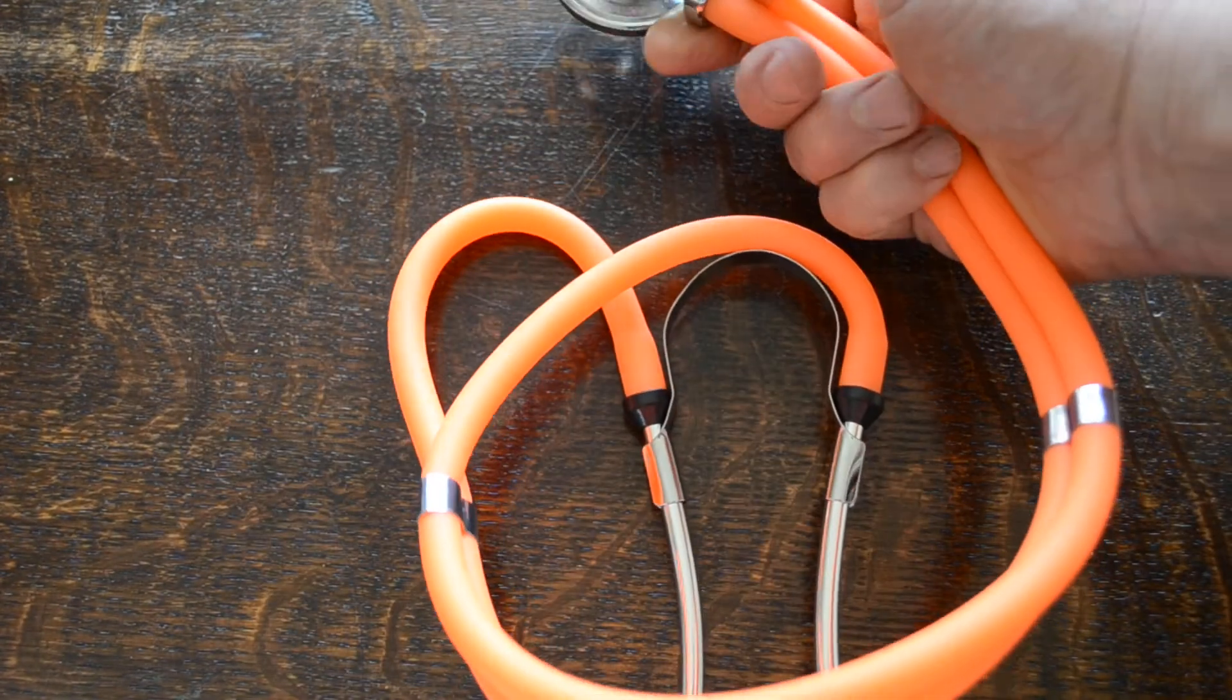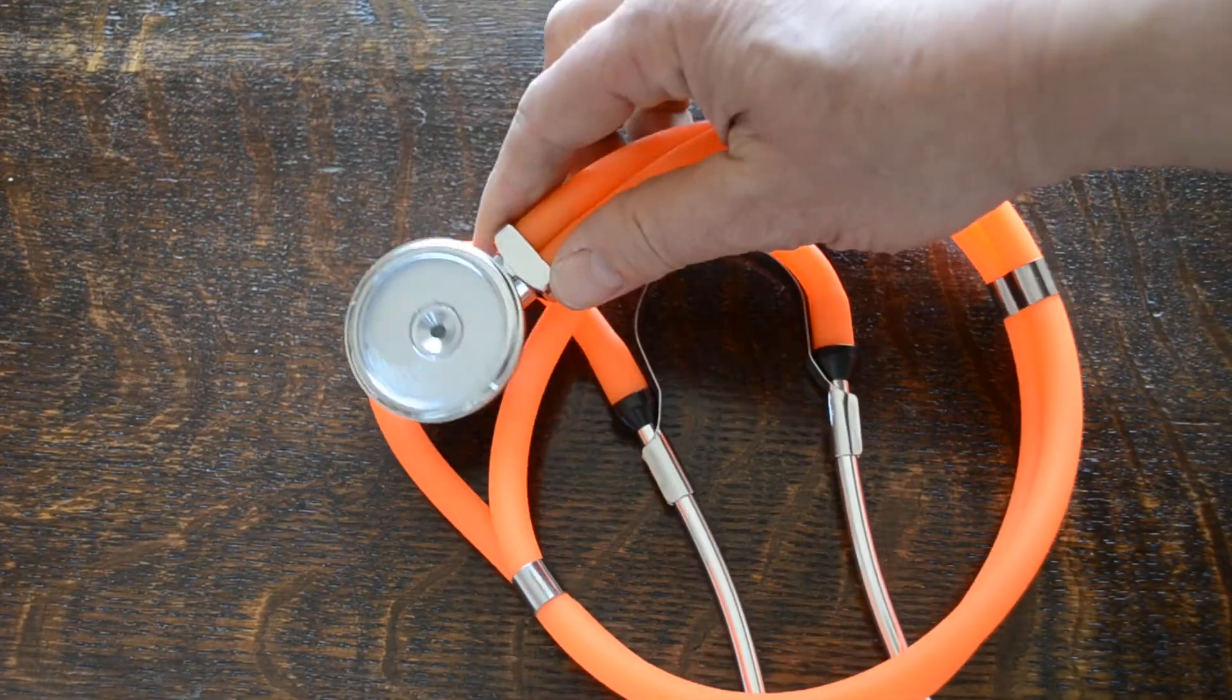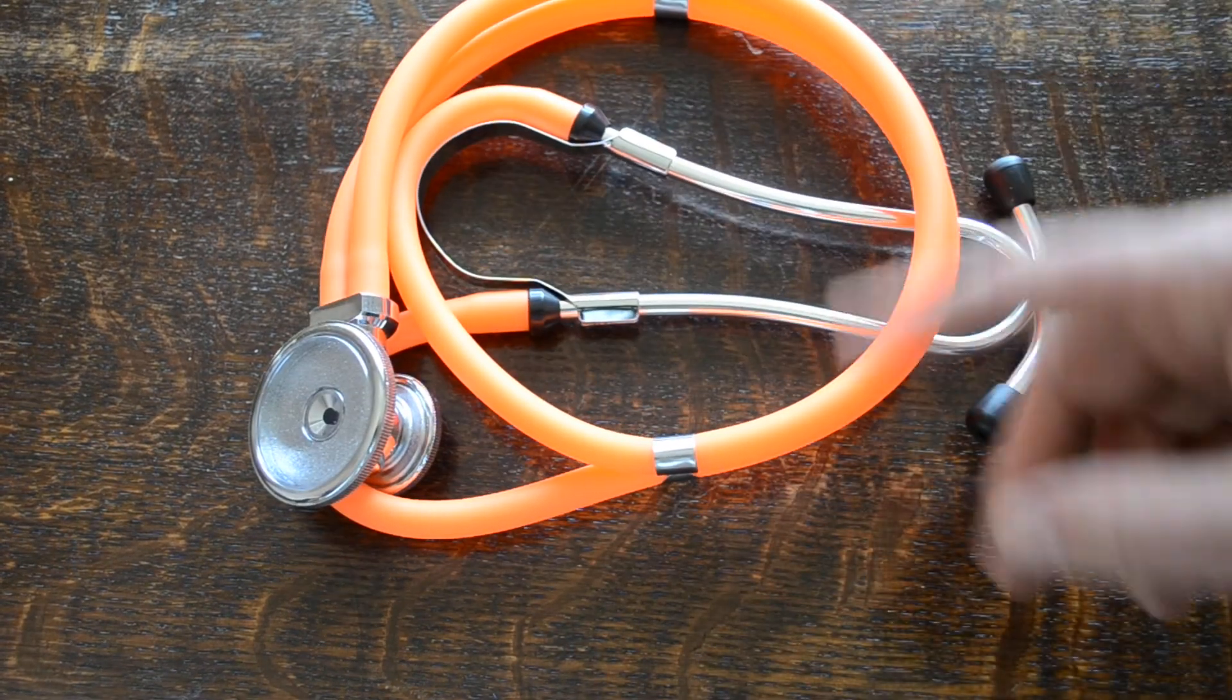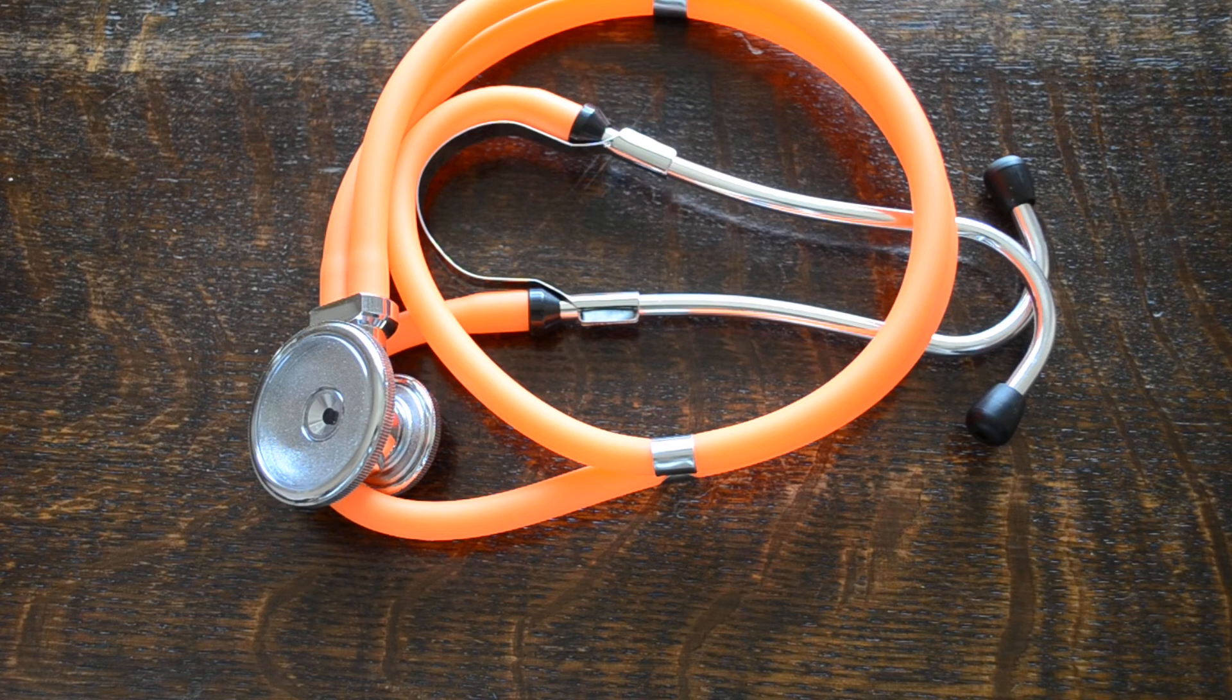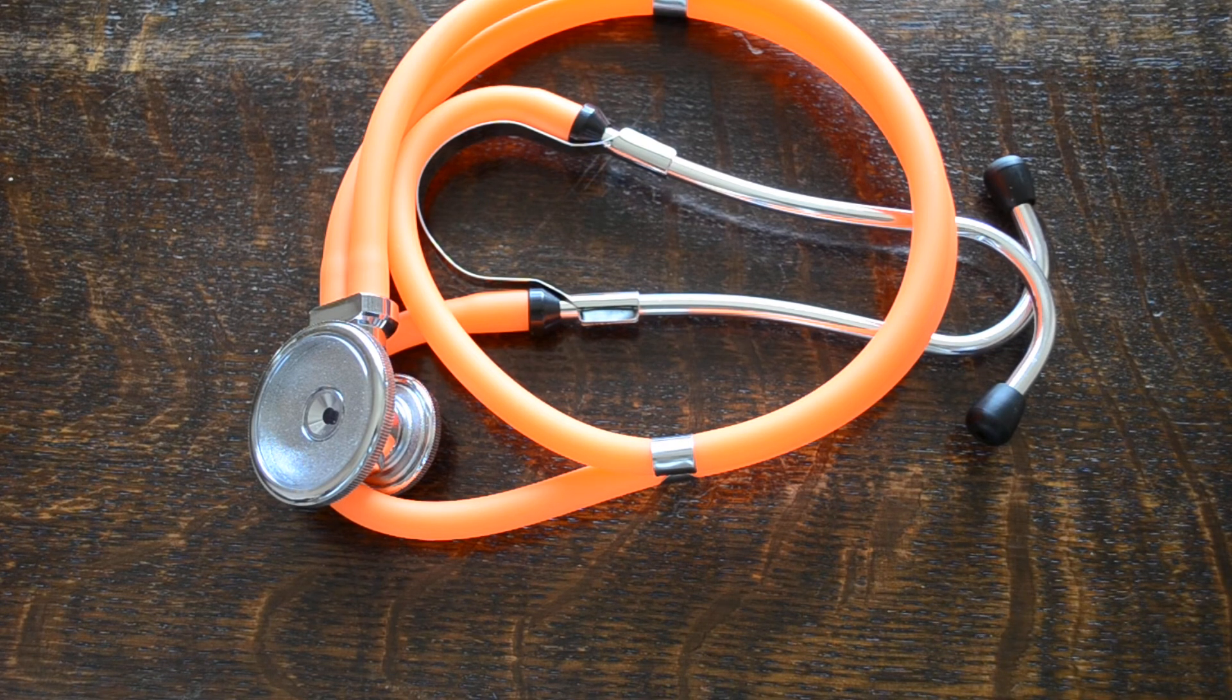There are options on here to have some engraving put on the chest piece if you chose to do so. But we'd normally recommend just identifying them with a self-sealing name tag that can be bought separately.